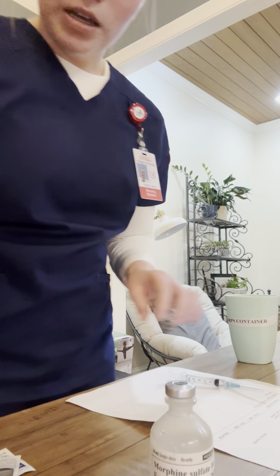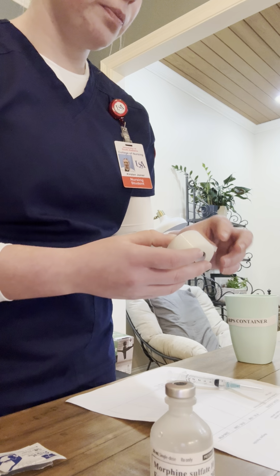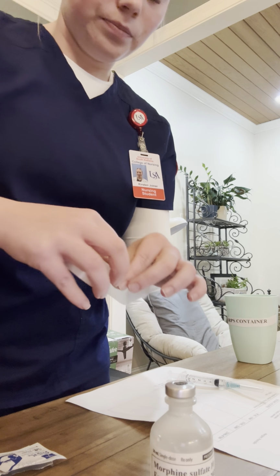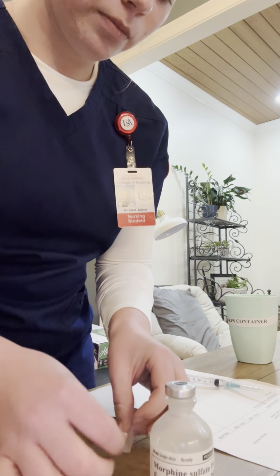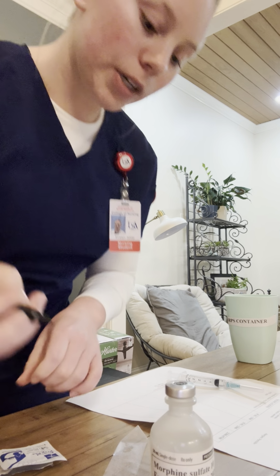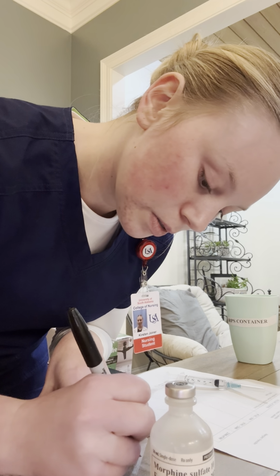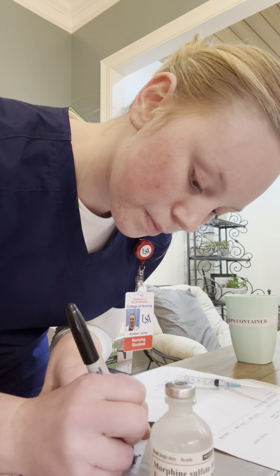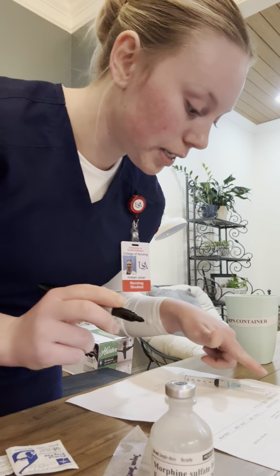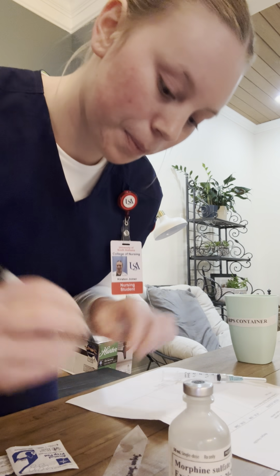So I am going to make my label. On our label, we're going to write our patient's name, Jaguar J. Jones. The drug is morphine sulfate.